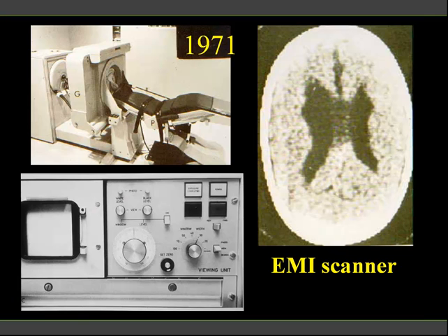Now, CT has a long history. I've been involved with most of this, and I'm fortunate to see some of these images from 1971 with the original EMI scanner. Basically, we had very little to worry about. We just looked at the window and level on the monitor, and we looked at those images which revolutionized medical imaging, enabling cross-sectional imaging of the human brain for the first time.